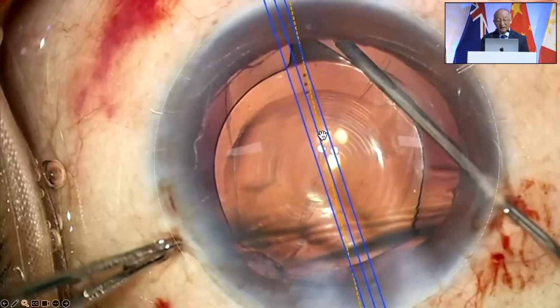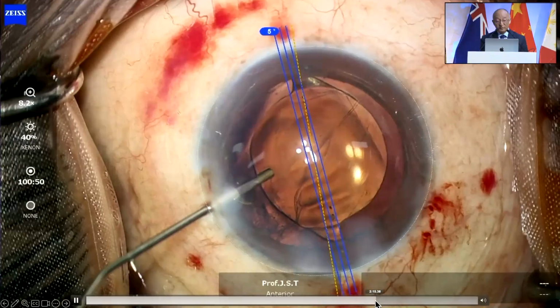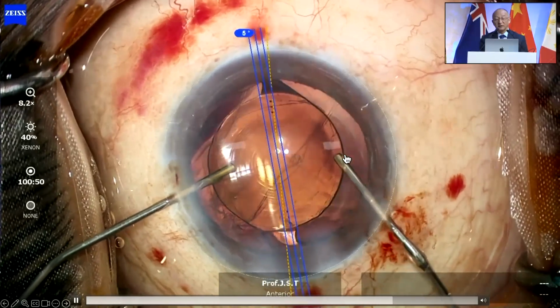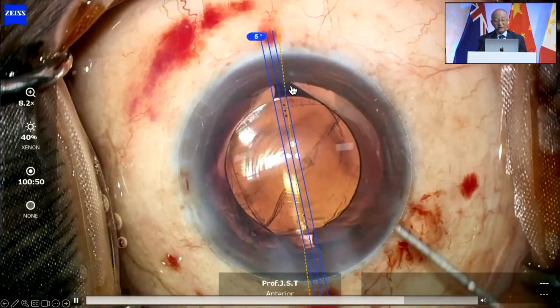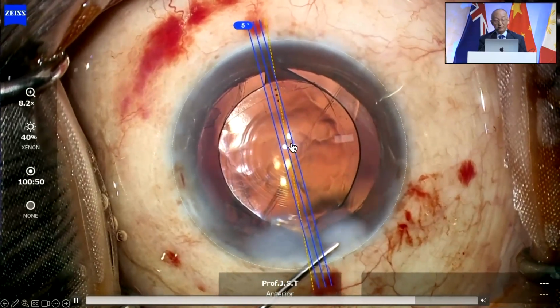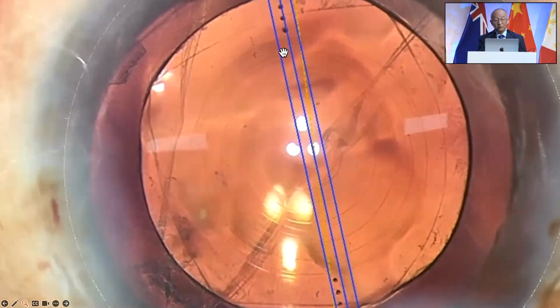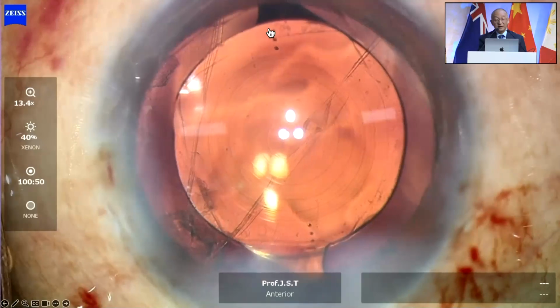I thought the better way would be to do a reverse capture in this patient. And this is a technique which is simpler, you can understand if you do a bimanual technique. If you see here, I'll inject dispersive from this side and I'll take another cannula from this side, and this will lift the optic over the capsulotomy, which is normally 4.9 millimeters for me, and maintain the haptics behind the capsulotomy. So you can see this will have a square shape now, and that is the end of surgery. You can see this is square shape, this is underneath, and this is over the rhexis, almost matching the dots here. So in that way, you can safeguard.